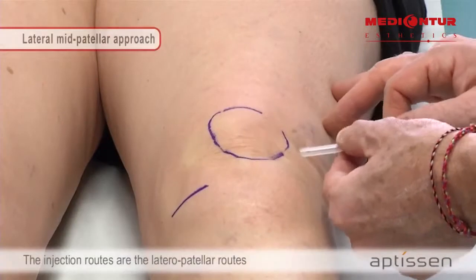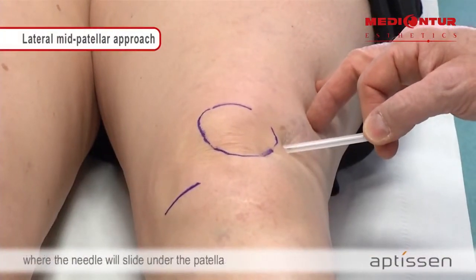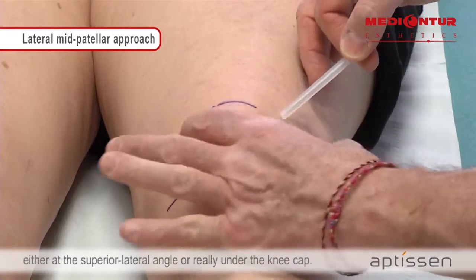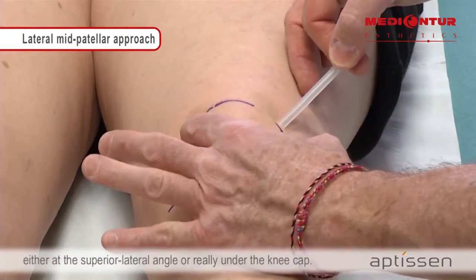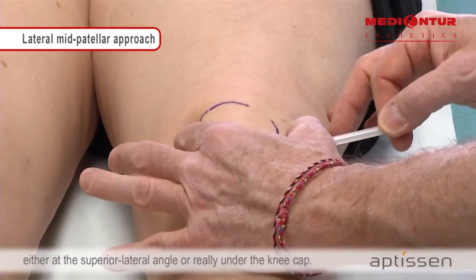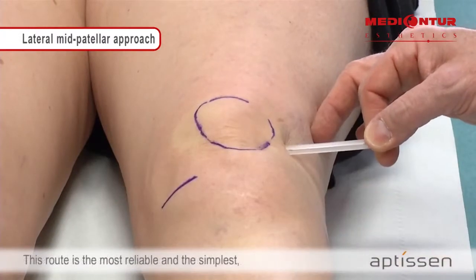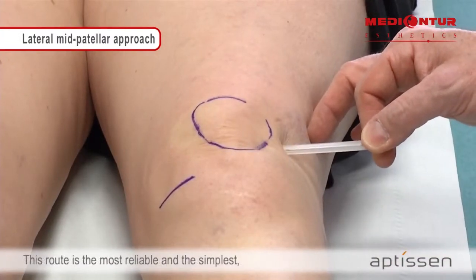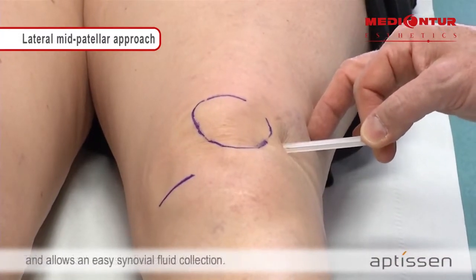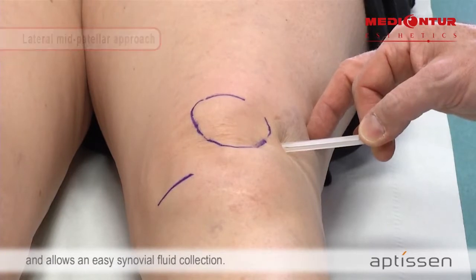The injection routes are the lateral patellar routes, where the needle will slide under the patella, either at the superior lateral angle, or really under the kneecap. This route is the most reliable and the simplest, and allows an easy synovial fluid collection.